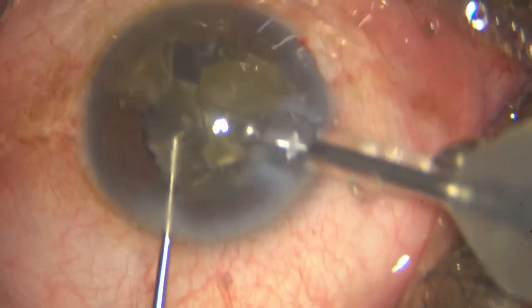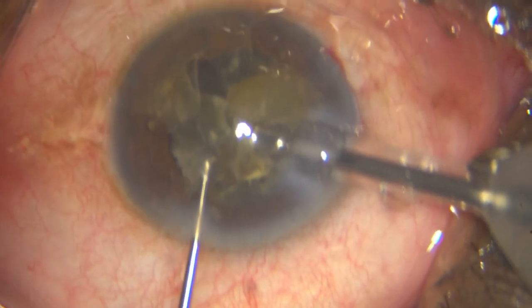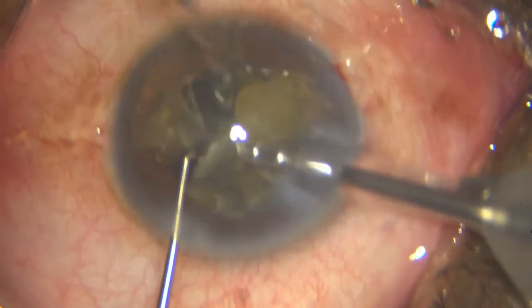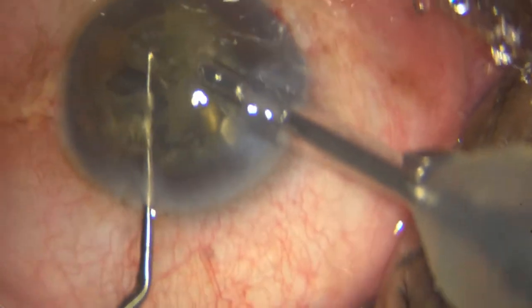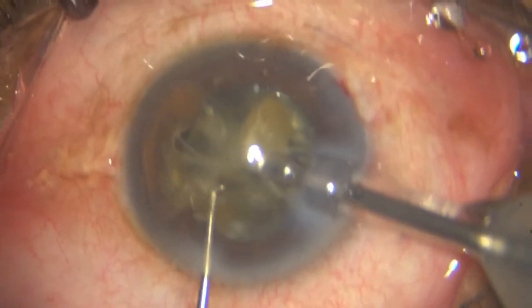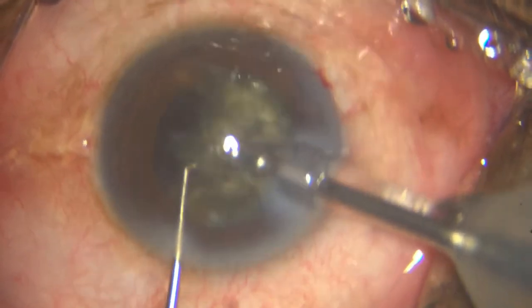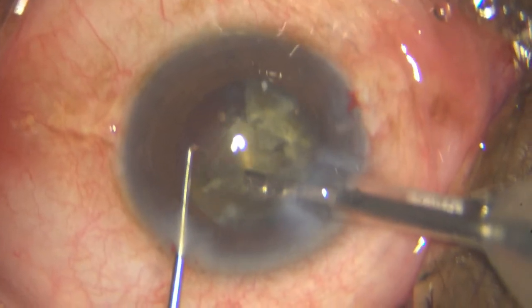Once I move to the next piece, you can see that central disc being eaten and then the chopped segment coming into view. Now it will become much easier.